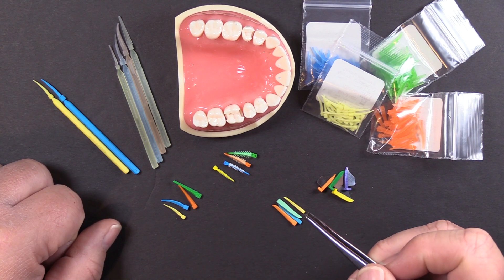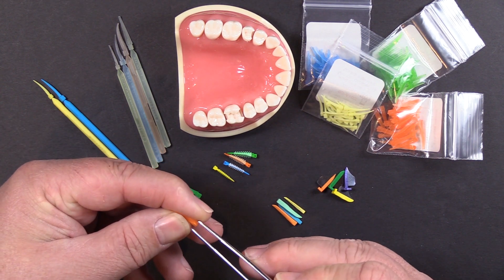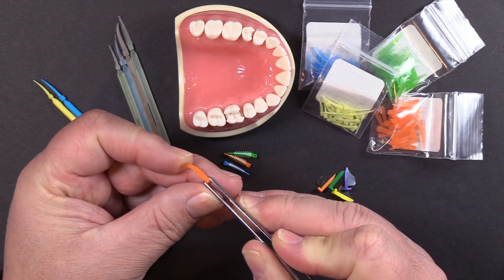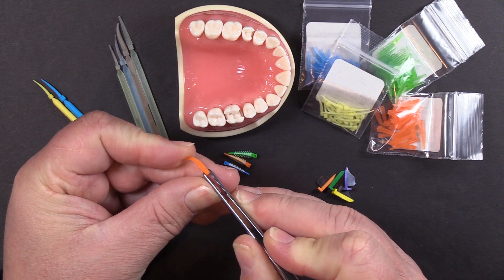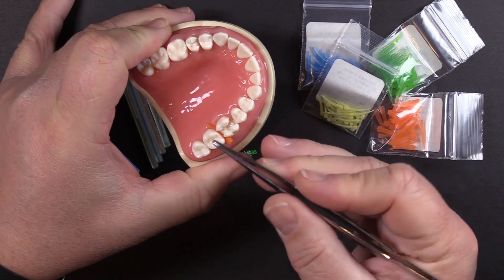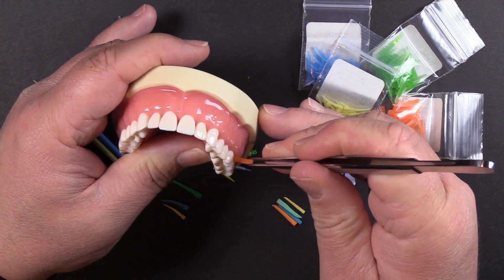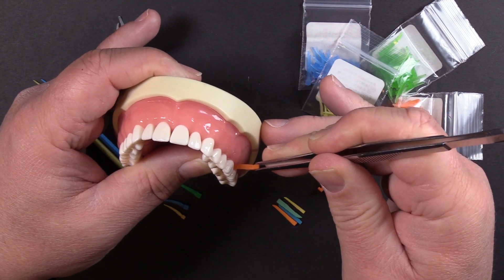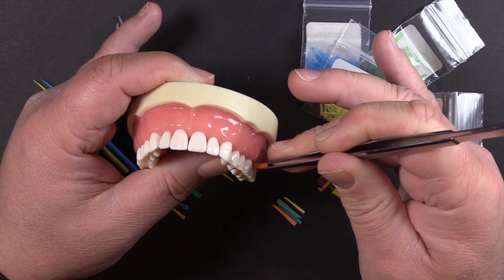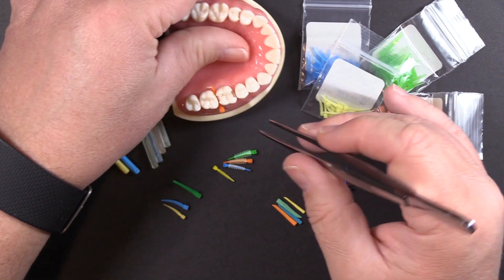A question I get about our plastic wedges is: how do I prevent piercing the gingiva? This applies to all of the plastic wedges. If you're having an issue with that, give the wedge an extra bend at the tip before you insert it — that'll help keep the tip riding up over the gingiva rather than piercing it. Also, use a little bit of a suture-type movement: start with the tip down just a little bit and then rotate it like a suture as you drive it in. It will go in easier that way.